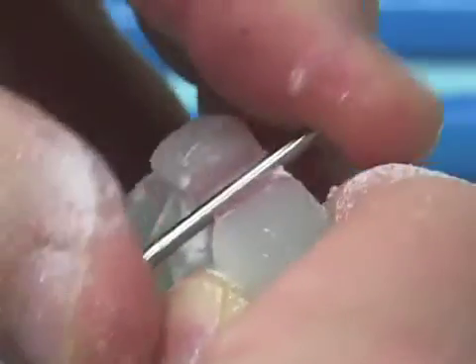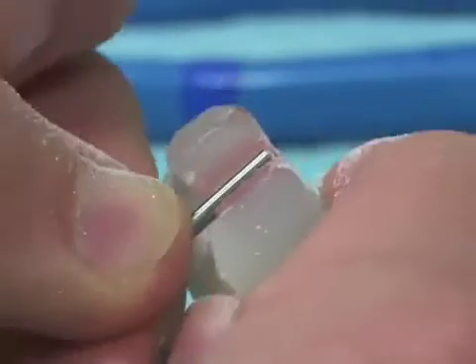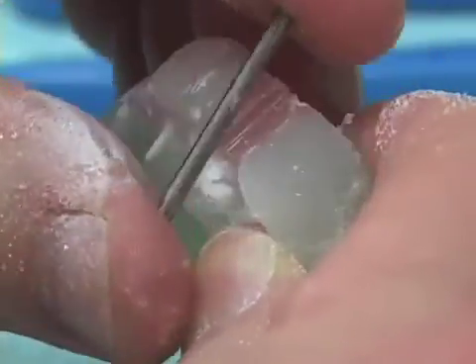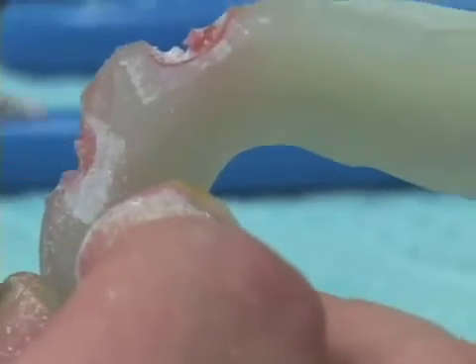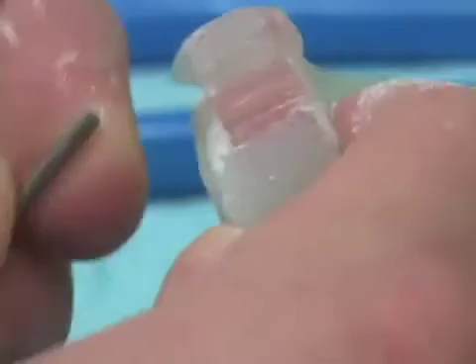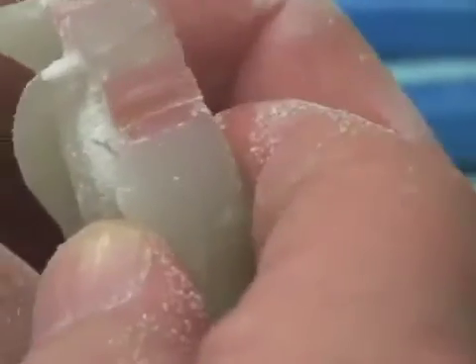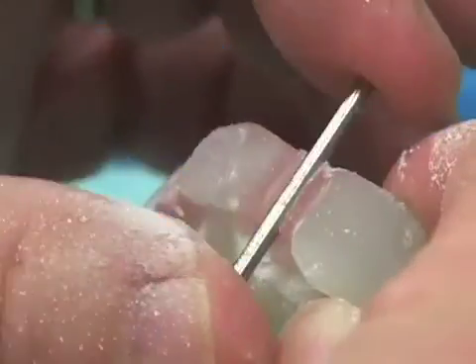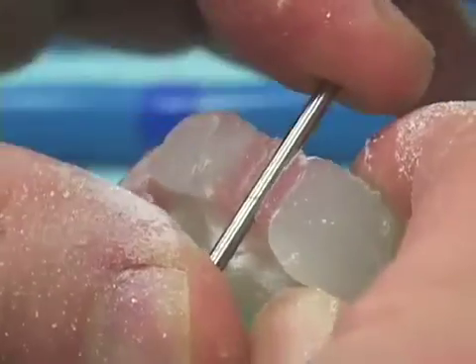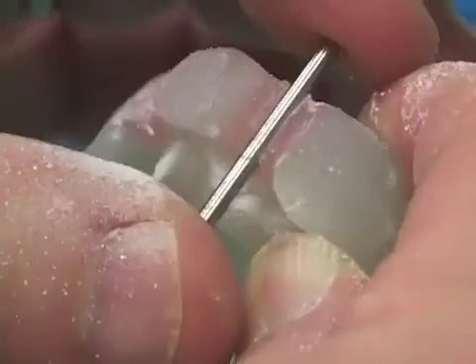And then, as we've done before with the single tooth implant, we want to be able to take our drill blank and thread it up from the bottom, making sure it goes to place very nicely, but it's a little bit tight. So I want to just carefully trim a little bit more at the sides. Again, thread it up from the bottom and see that it passes freely out to the buccal, which it does, or the labial. And then again, always grabbing my drill blank top and bottom, see that it goes in and out freely, but then once it's in place, there's no mesiodistal sloppiness at all. So it's firmly positioned, but has free access from the buccal or labial.